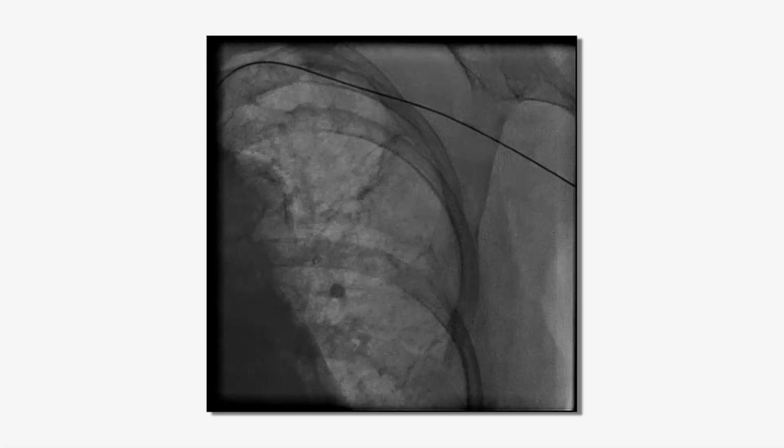If that doesn't work, and there's some resistance because there's some calcification or there's a lesion, you take a multipurpose. The multipurpose is much straighter. It almost always goes up. And at that point, you can either do the entire diagnostic with the multipurpose, or you switch over to your J-wire, which is a more supportive wire, and then you can deliver everything.